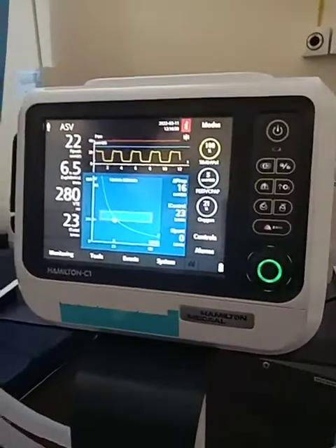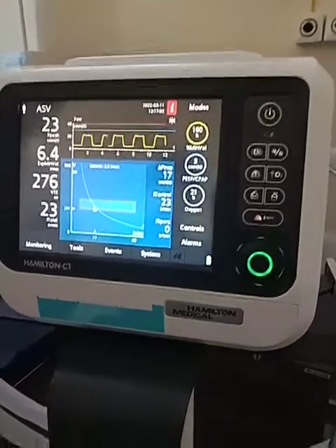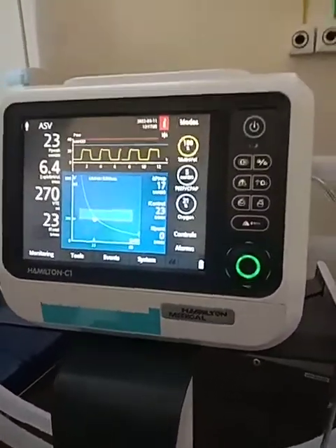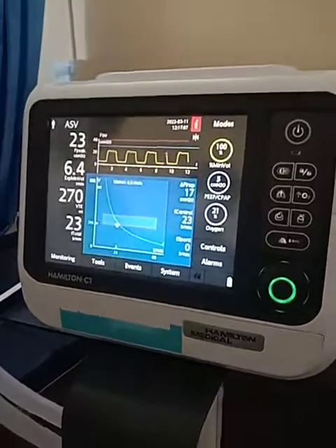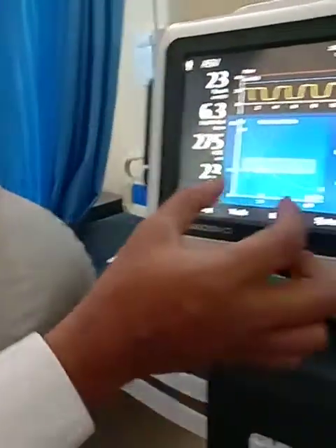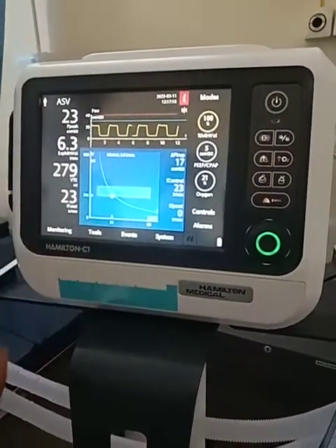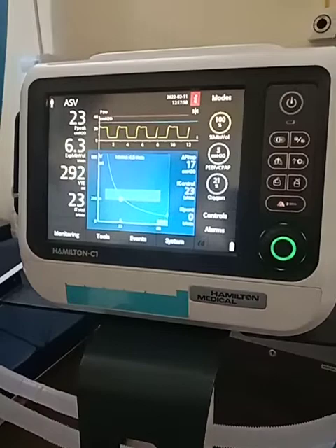Sorry, sir? We usually keep within 23... Yes, this is an ARDS simulation patient, a stiff lung. So in that case, it has understood. Let's say an ARDS patient. That's why it has a pattern where you have a higher breath rate frequency, but the tidal volume will be lesser. Now the same way, if the patient starts breathing, what are the changes you can see?